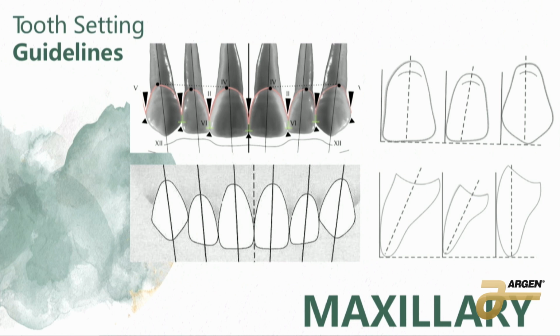And it is okay to be training new technicians in a digital setting. One of the biggest issues that I heard last year was, I don't have removable staff. I don't have technicians that know dentures. So I started to ask around to the people who do, and I was like, where did you find this person? And the answer was always the same: I hired some guy and I trained him. And it's okay, now that we're coming into digital. I know there's a lot of us that want to hold on to that and say, well, I burnt all my knuckle hairs off and I don't have fingertips anymore, and you need to learn analog.